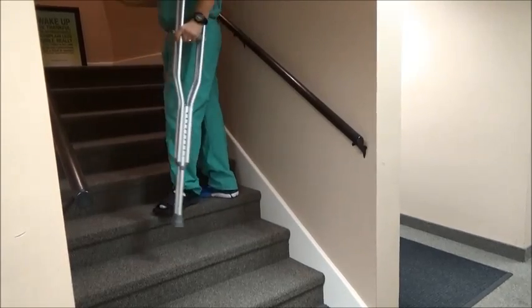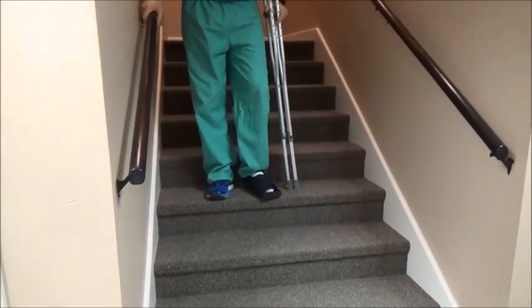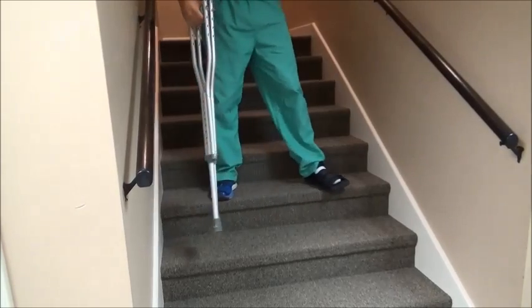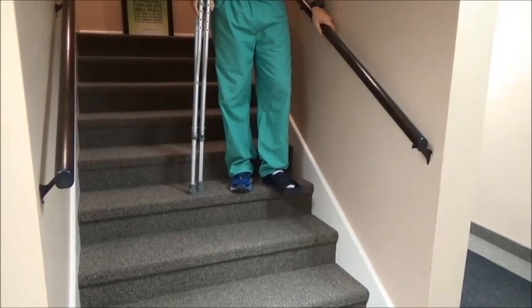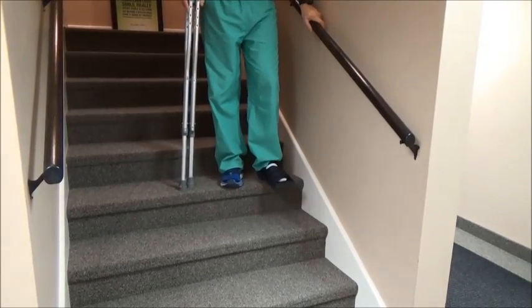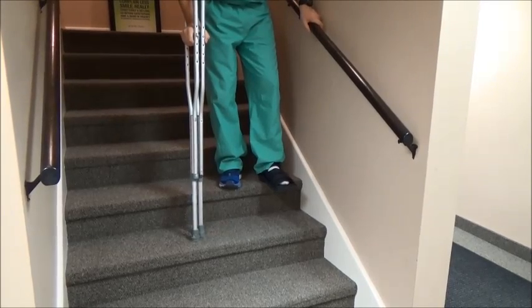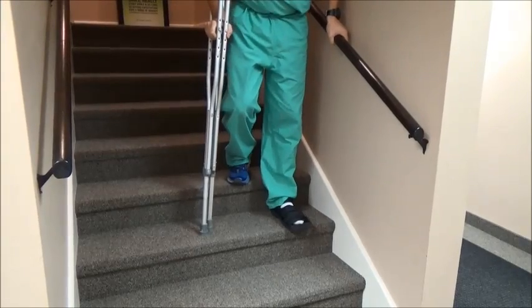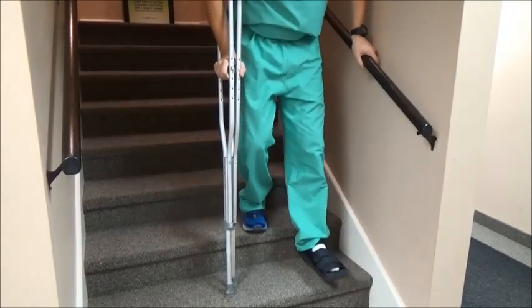When descending stairs, the phrase is "down with the bad" — you always start with your bad foot. Not every stairway has two railings, so you may need to switch the crutches to the other hand. Before stepping down, place the crutches on the next step, grip them firmly, hold the railing tightly, step down with the bad foot while keeping pressure off it, and then bring the good foot down. Continue that all the way down the staircase.